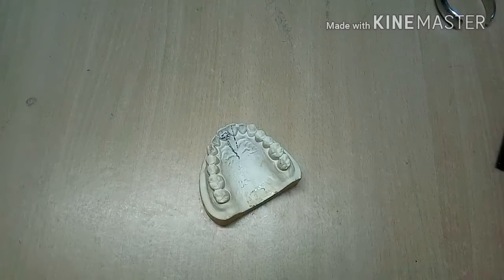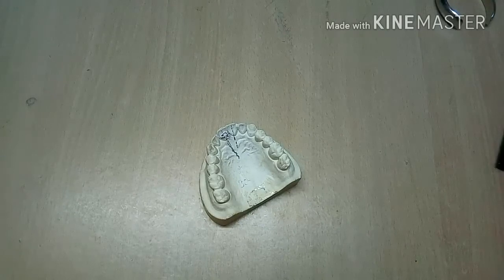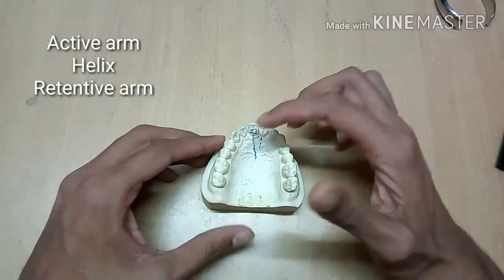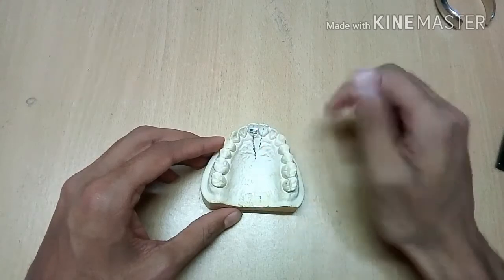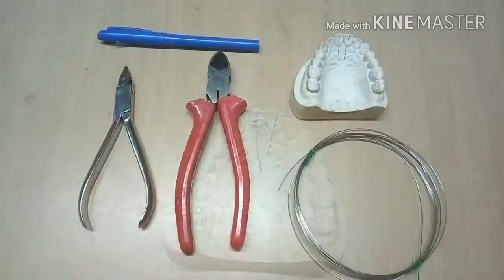Hello, today we will be learning about the Zed Spring, also called double cantilever spring. I have already made a Zed Spring — this is how it looks. It has an active arm, a helix, and a retentive arm. It is used for rotational or labial movement of the teeth.